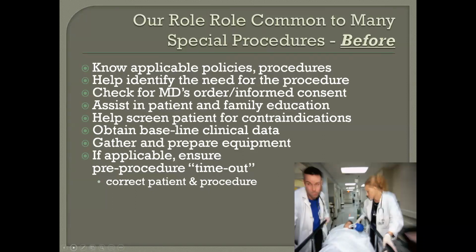Many times they'll be given some xylocaine to numb the airway. You may have some lidocaine gel that you put in directly to numb the mucosa. The tube that's put in for spontaneous breathing, probably going through the nose, is about the diameter of a small coaxial cable, things along those lines. Many times we'll be in your bronchus for a short period of time. We may take some pictures, we may suction some samples out, and then we'll take the device out.